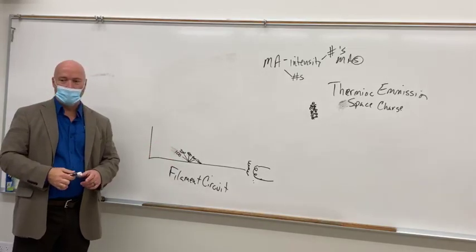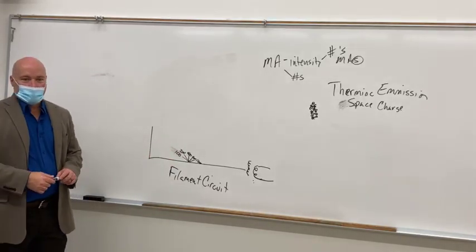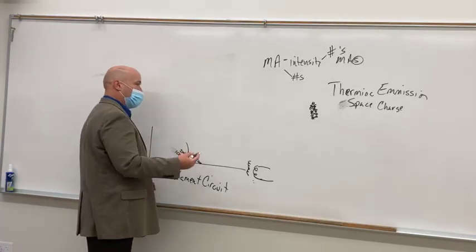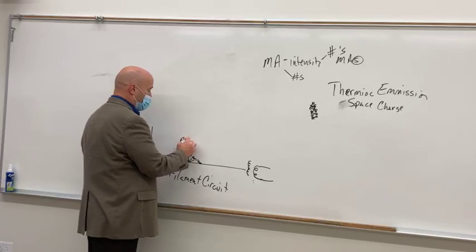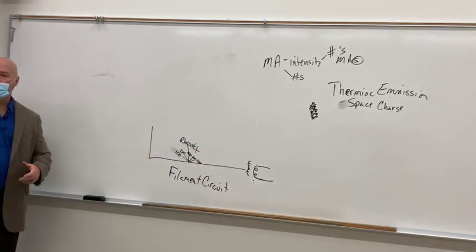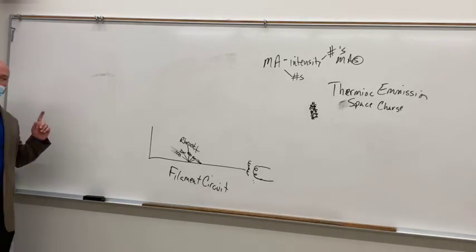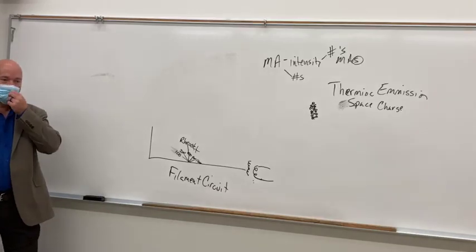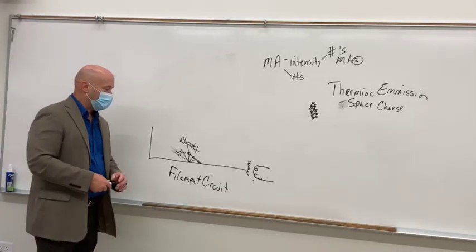So what is that? It's a rheostat, right? So the auto transformer is not the only rheostat you have. That's a rheostat as well. In this case, it's an MA selector with the auto transformer. What are we selecting? KVP, right. So it's a rheostat, it's just adjusting different things.